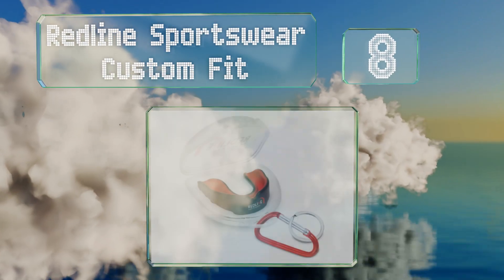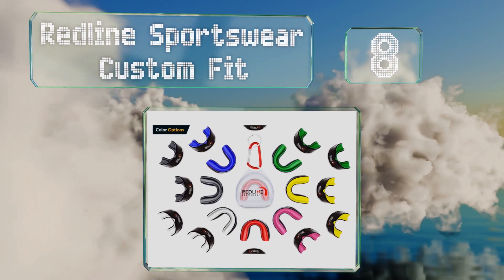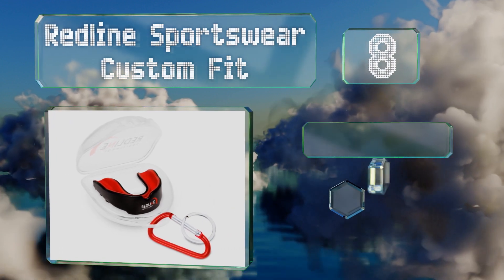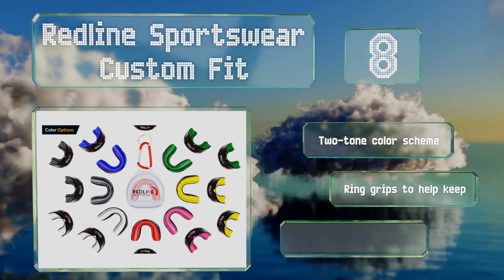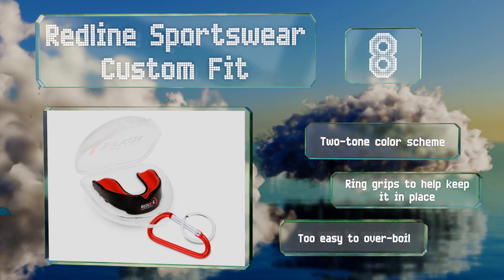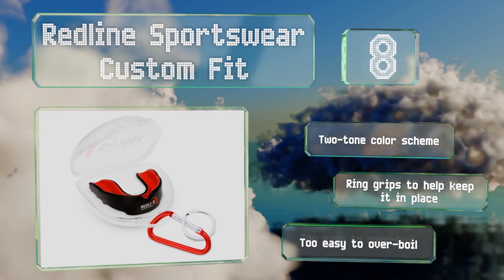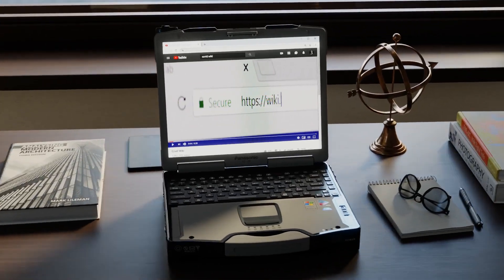Coming in at number eight on our list, if you often lose your mouth guard you may want to consider the Redline Sportswear Custom Fit. It comes with a ventilated case that can be clipped to your bag so you can store it safely when not in use without having to worry about bacteria build-up. It sports a two-tone color scheme and is equipped with ring grips to help keep it in place, however it is too easy to overboil.